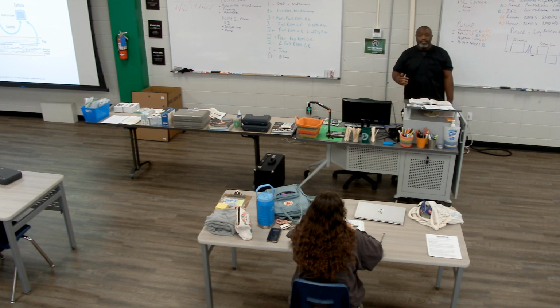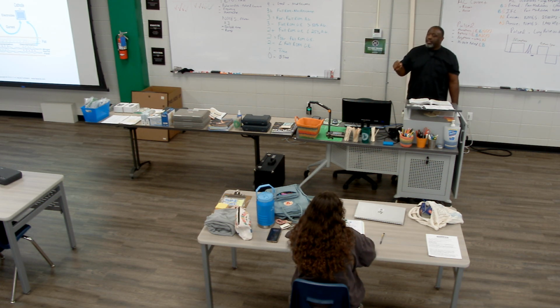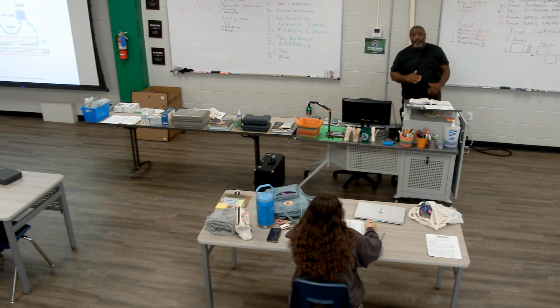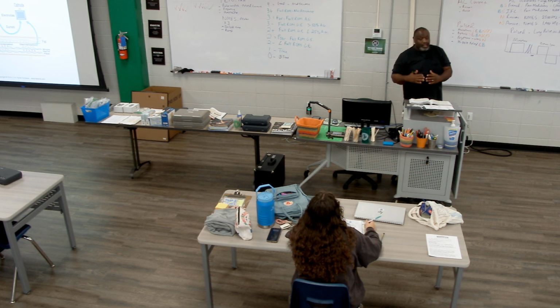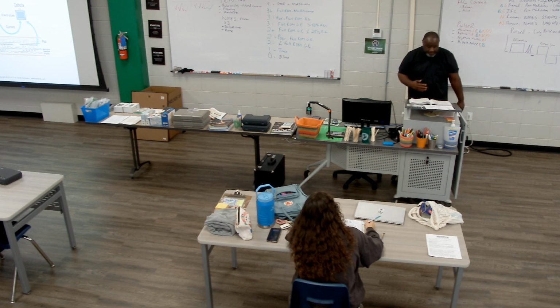But when we're dealing with it, we normally want the cathode, or the negative, to be the one where electrical energy will be drawn into first to be used underneath the skin because of that attraction. A negative electrode, positive nerve cell, they draw to each other.